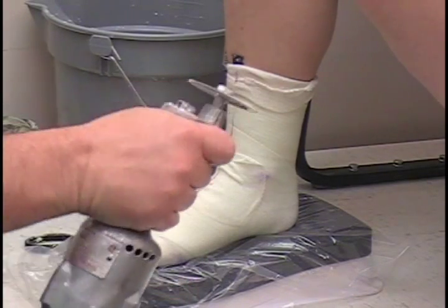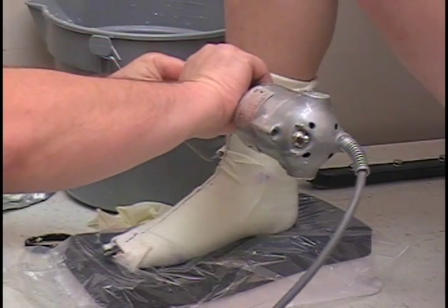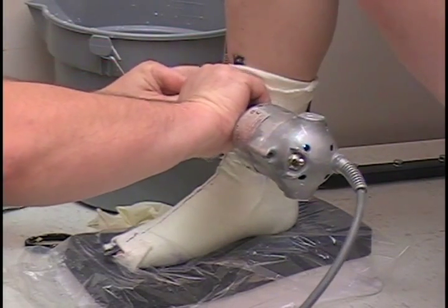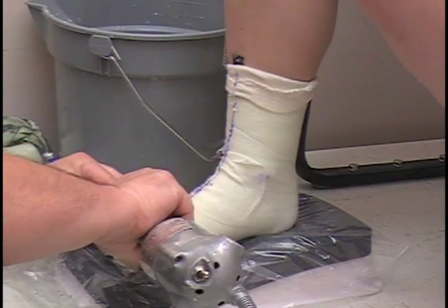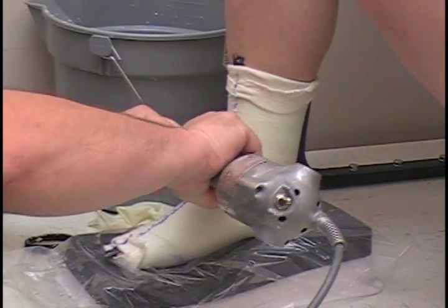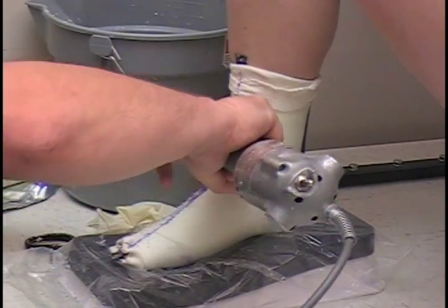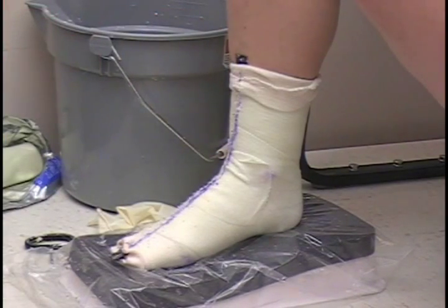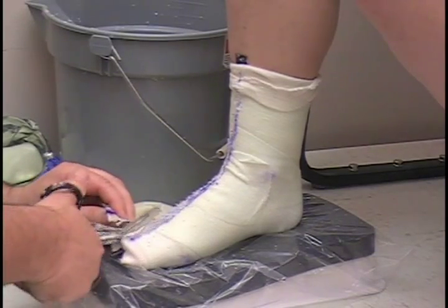Okay, here we go, we're going to cut it off. The casting saw doesn't like to cut the cotton stockinette, so you're going to have to catch that with the scissors.